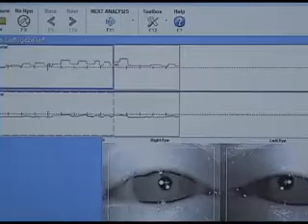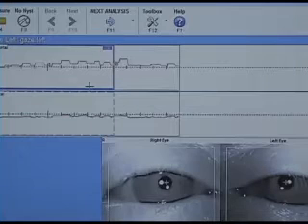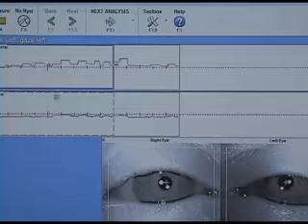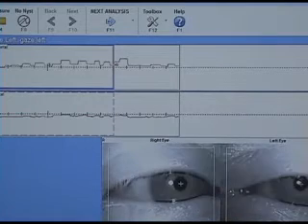Here's another example of gaze testing. This is gaze to the left. This is a patient that has a balance disorder and what we call ataxia, trouble walking and dizziness. You can see up and through here still a lot of right square wave jerks. This is a separate patient. We can watch the video of this individual.